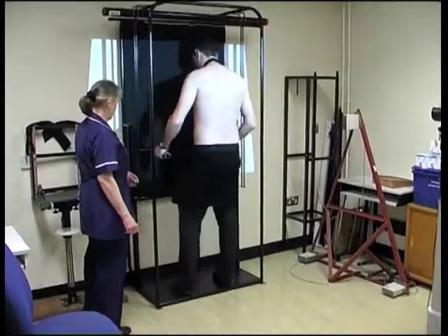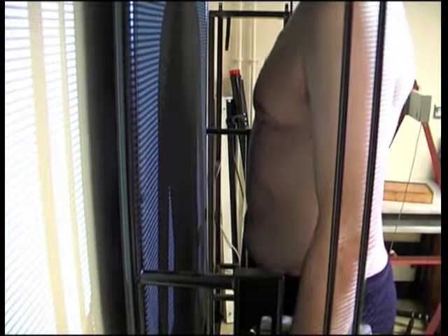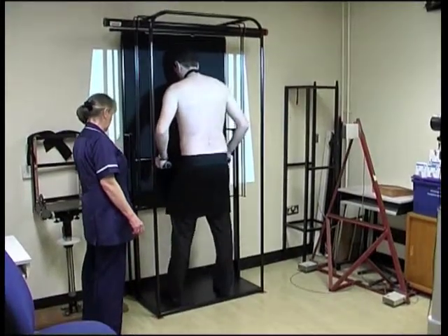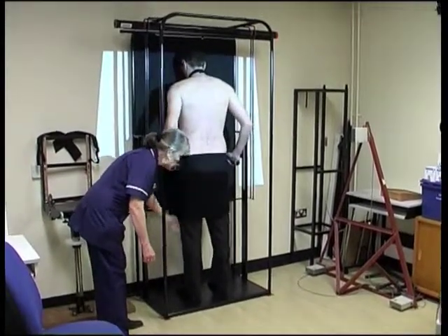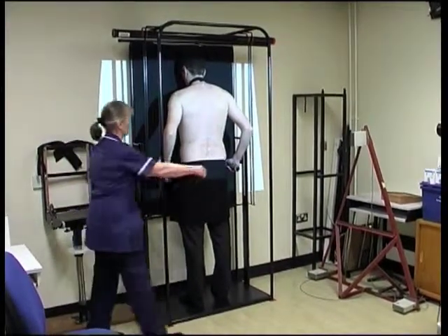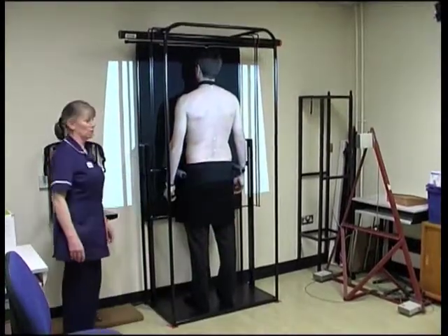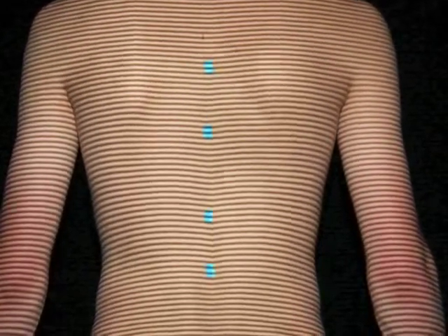Then you have to stand in the patient stand with your back to the camera. You shuffle forward in the stand until your tummy touches the horizontal bar. Then we check to make sure your feet are a little apart, and your arms are kept away from the sides of your back by the arm supports.